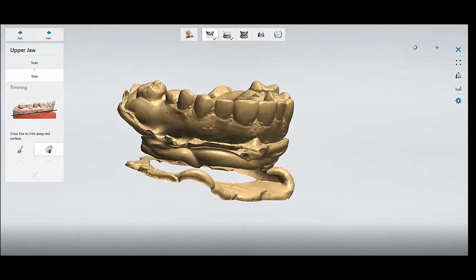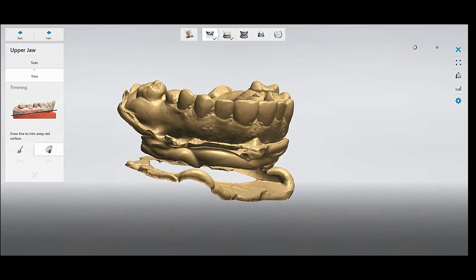Welcome to Digital Dental Technology Solution. In this video, I will show you how you can trim with a desktop scan or intro scan, or you can trim and make it look very nice. Just have a look.